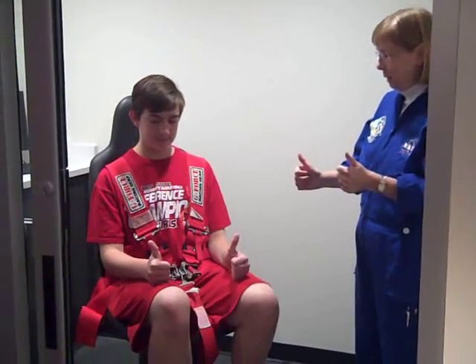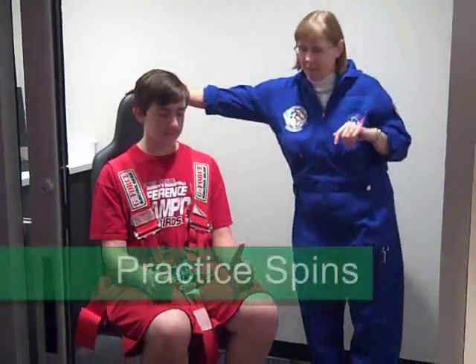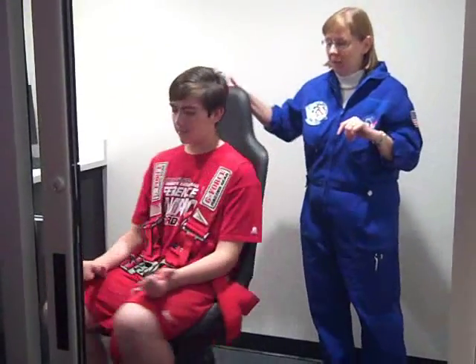The crew member's feet will go behind the bar and you will begin practice spins. First, thumbs up on their thighs. When their thumbs are up, this means they are not moving. When they feel the spin, they will tilt their thumbs in the direction of the spin. Do a couple practice spins — notice this crew member is pointing his thumbs in the direction in which he feels his chair spinning.